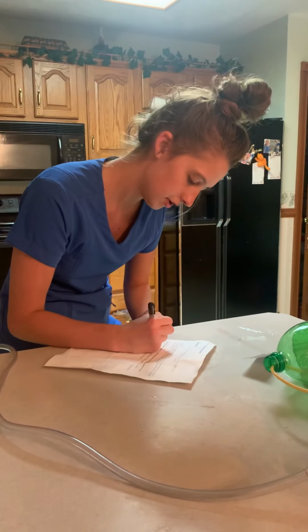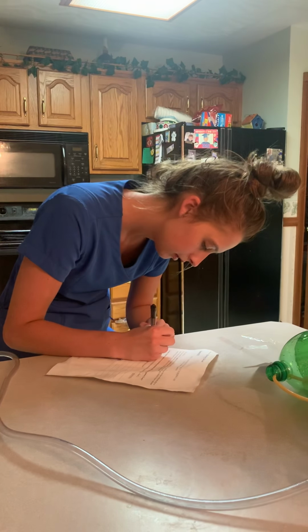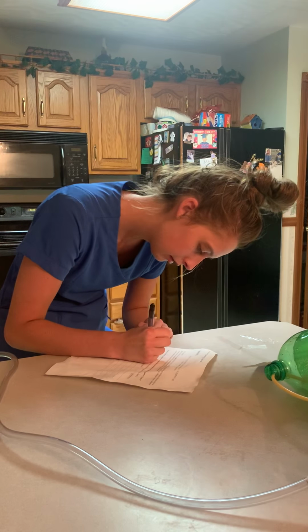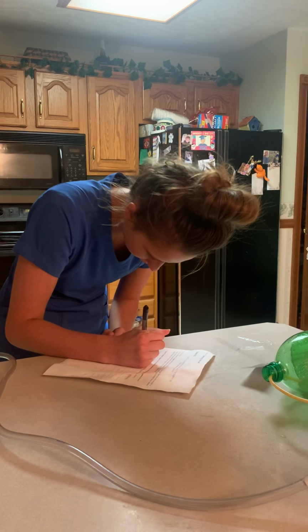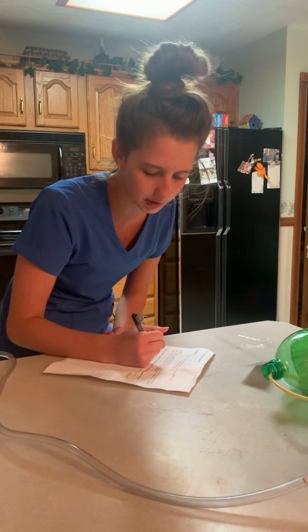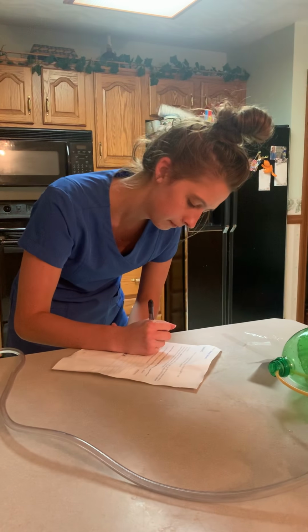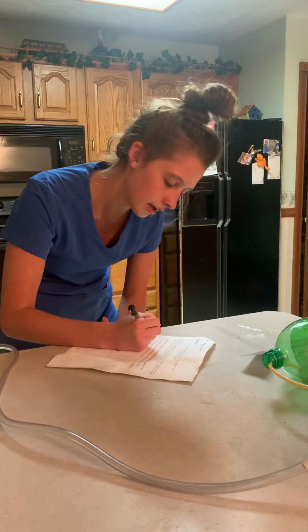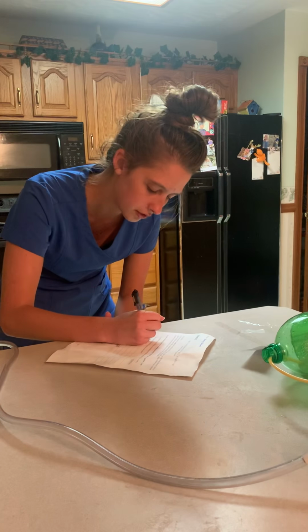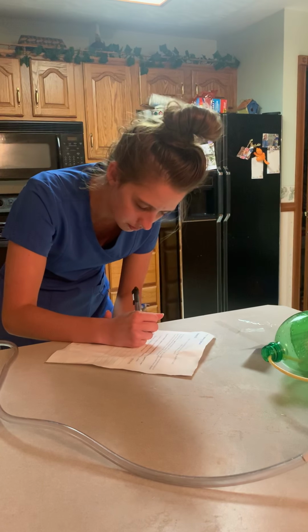Okay, so I'm first going to state that the urine is a pale yellow color. And then I'm going to say that the urine output was 150 milliliters. And the patient well tolerated the catheterization throughout the procedure.